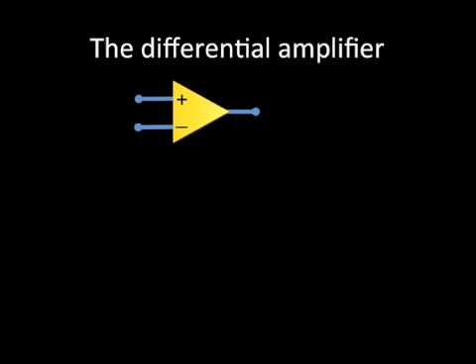In order to understand EEG well, it is important to understand polarity rules. The basis of EEG recording is a differential amplifier, which detects signals from two inputs, shown here as input 1 and input 2, and gives an output as the difference between these two signals. Brainwaves recorded on EEG have amplitudes in the order of microvolts.